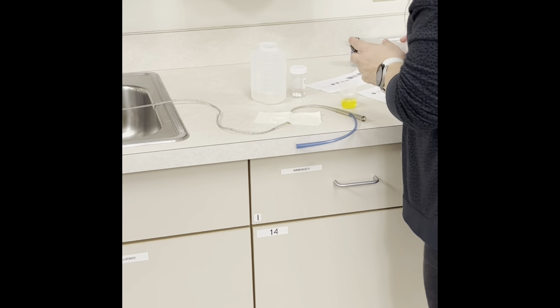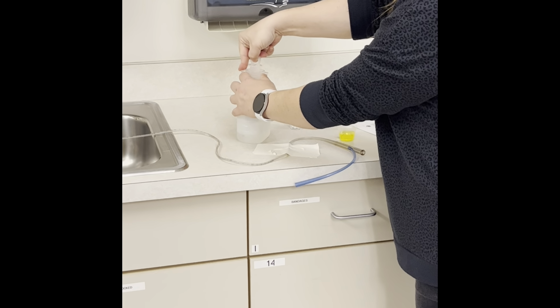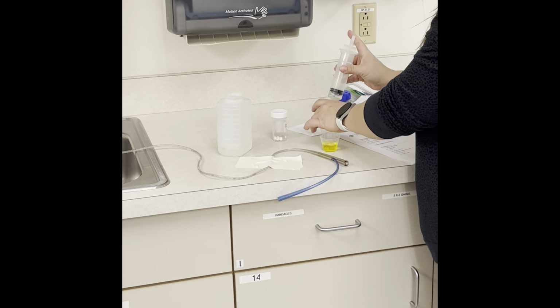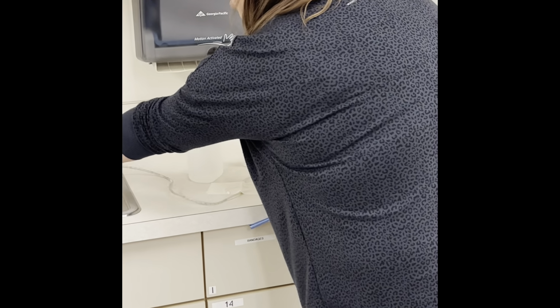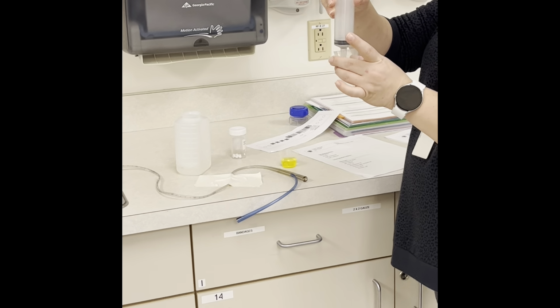All right, so now it tells you we're gonna mix the medication. It does say 20. You can just do like 10. It's gonna be a lot of water if we do. Like this isn't gonna hold all 20 in this medicine cup. So we need just a little bit of water. You'll see me pull out the end when you're at this part because I just don't want to contaminate it at all. You're gonna take the end of the 60cc.